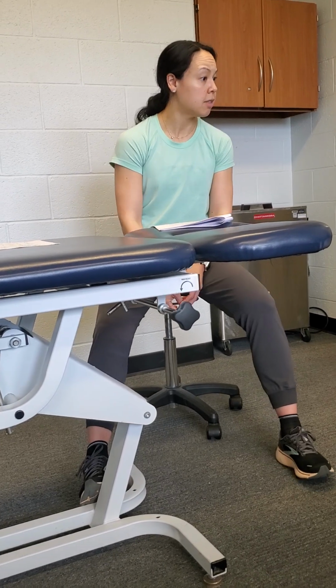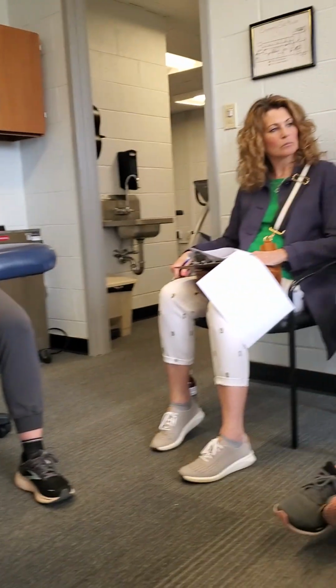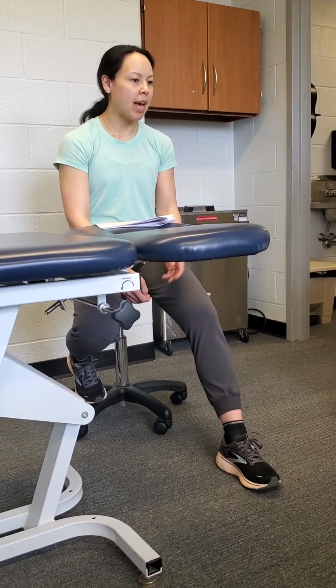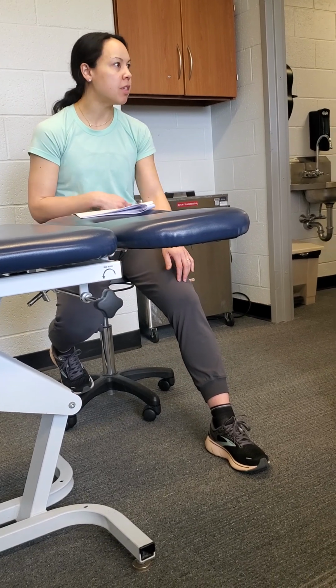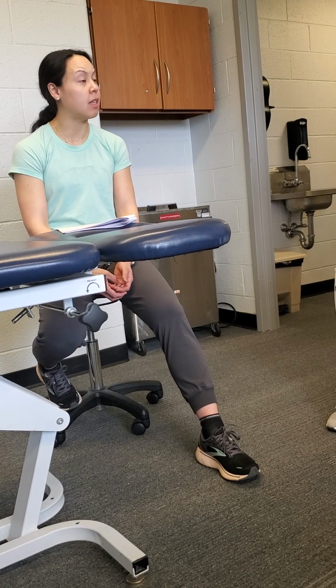I have a quick question. Yes. With the passive BFR, the only thing I'm thinking is that 2 days post-op there are incisions, right? And it says here to wait 2 weeks, but a lot of this is saying do it at 2 days. So are they talking about the contralateral limb, or are they just doing it at 2 days? No, so that came up during the course too: what about the incision, is the incision not healed by then? And generally, it's not an issue.